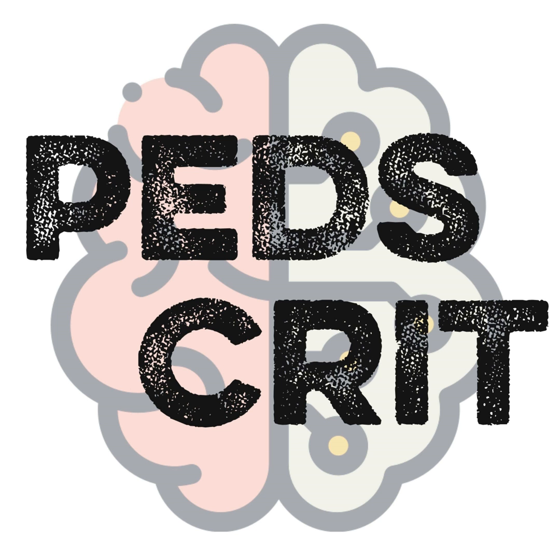Another area that's really interesting is use of APRV during ECMO as resting lung settings. There is maybe some traction toward increasing use of APRV and studying APRV during VV ECMO right now, but nothing out there is really definitively saying it's helpful or not. But I did use APRV as rest settings occasionally in my PICU fellowship. So I think those are areas of great interest that could be studied in adults and pediatrics.